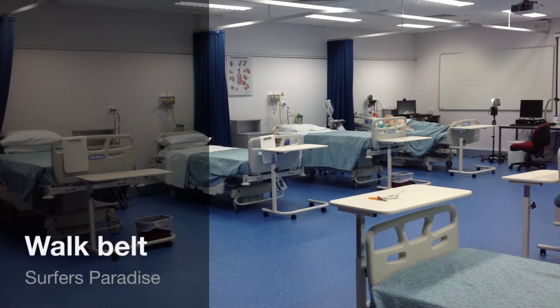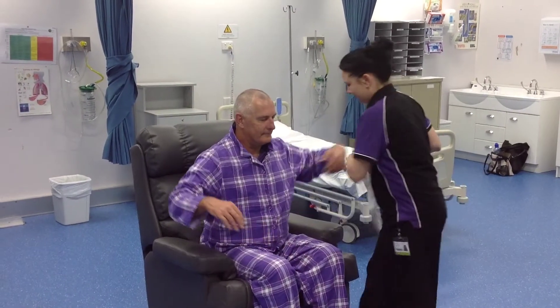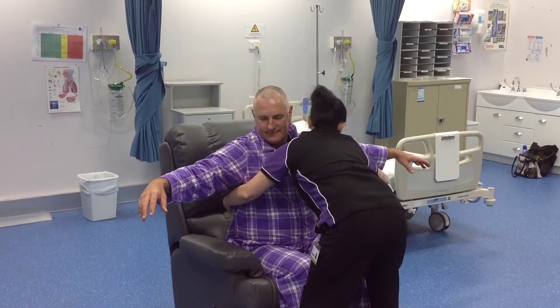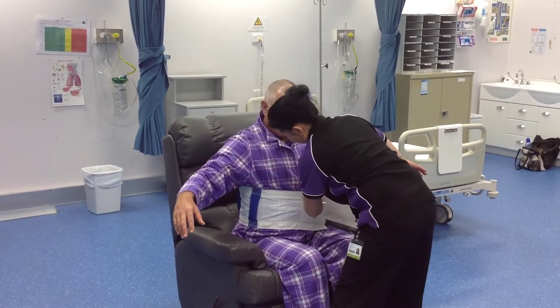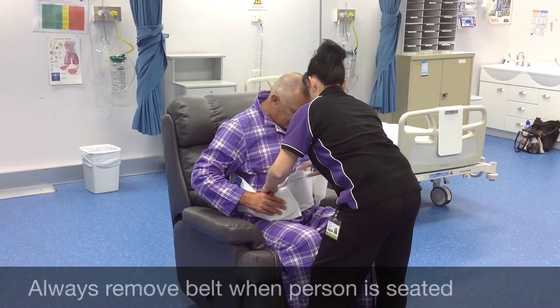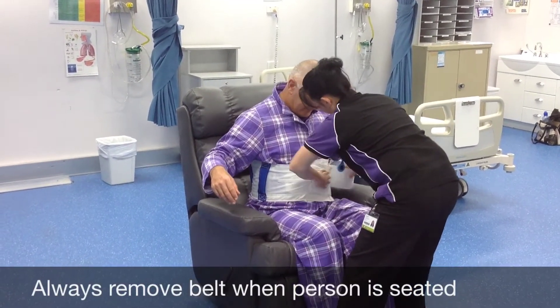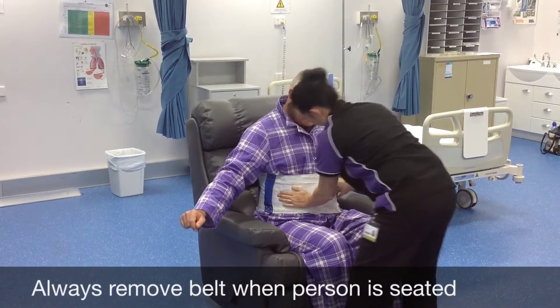Let's look at walk belts. We use these to help our clients who are a little bit unsteady on their feet to stay mobile. They are walk belts, not lifting belts, so we do not lift people with them. They go around the waist and they must fit snugly — they do come in different sizes. If you have ladies with large breasts, please put the belt underneath and not over the top of the breasts.